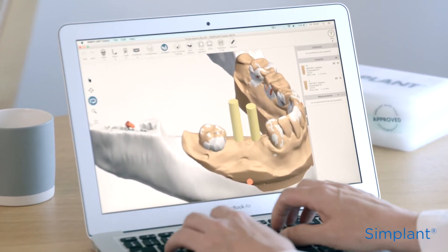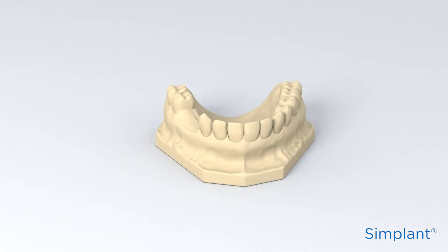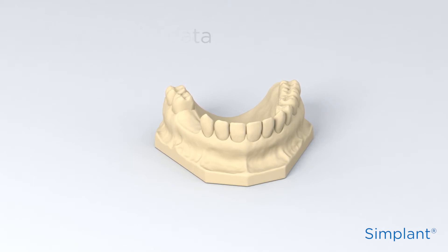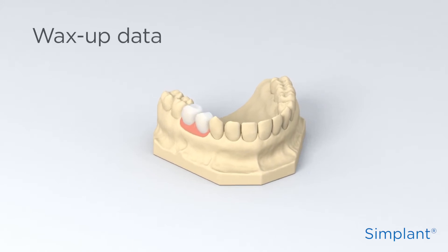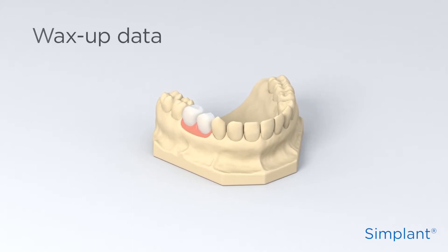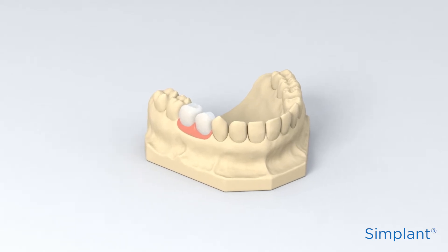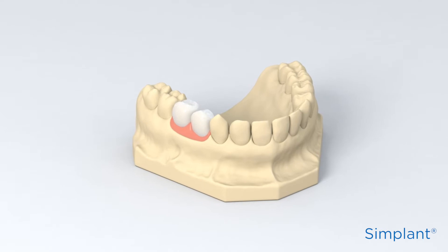The stone model provides information about the remaining teeth and soft tissue. It's used to design an accurate Simplant guide. The wax-up provides information about the crowns that need to be restored. The Simplant technician will integrate both stone model and wax-up into the planning file.